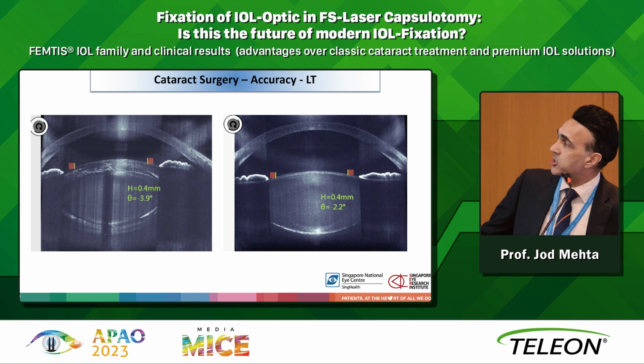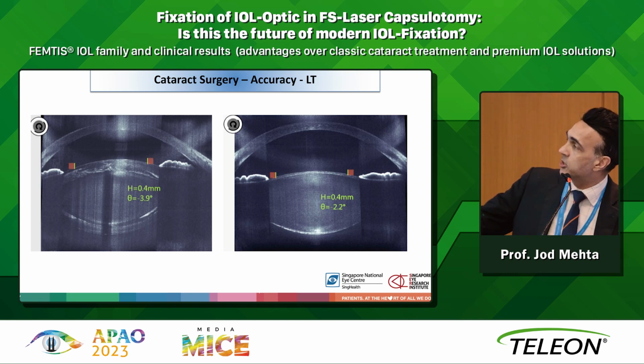This just shows you two patients of mine I did recently, and Dennis captured this for me from the ZA. You'll see these two patients, routine cataract surgery. Look at the difference in the thickness of the bag from one side to the other side.